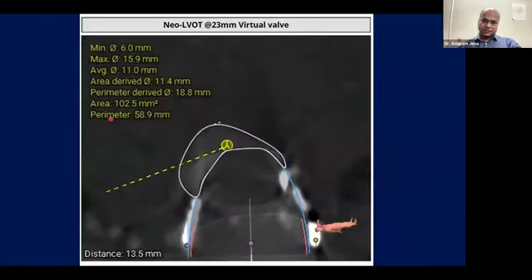In this case, the problem is the neo LVOT was coming around 102, which is prohibitive. We should not do this. But again, all these are surgical turndown. The patient has a mean transmitral gradient of 27. Patient has a resting pulmonary edema. Creatinine is 2. Patient already underwent double valve replacement. But the aortic valve was not that stenotic or regurgitant. However, the mitral valve was completely degenerated.